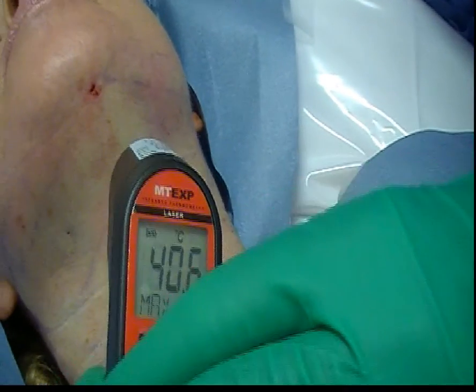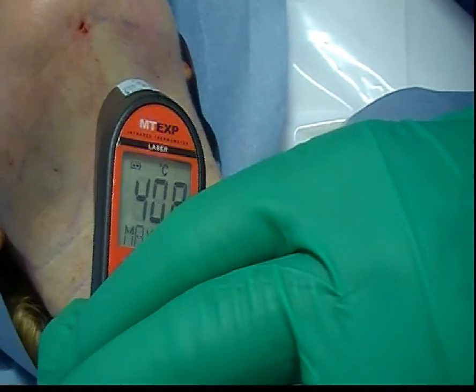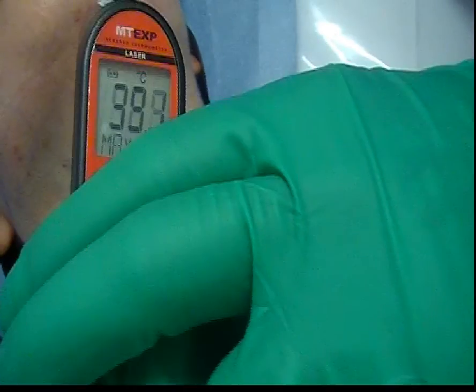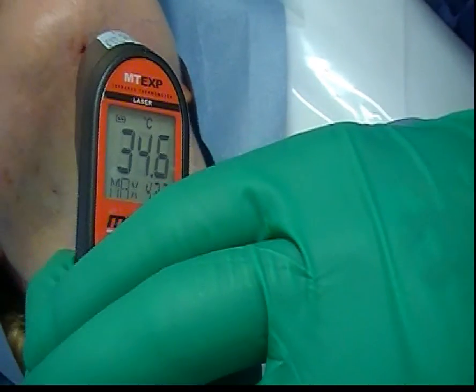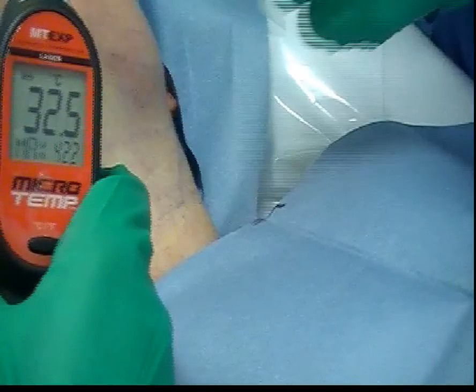Just delivered another 1,000 joules to the center of the neck. The external temperature is varying between 40 and 41 degrees at the base. If I move up to the top, it's a little bit lower — so the temperature does build up quicker at the base of the neck. I'll deliver a little more just under the chin here and then move on to the other side.